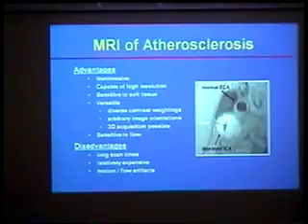But MR does have some disadvantages. The first one is that the scan time tends to be fairly long, especially compared with CT or ultrasound. In this case, you can get images of this type in several minutes; if you had a technique that can get images in real time, that certainly would be much better. Also, MR is relatively expensive. So if down the road we were to use this kind of technique as a screening tool, we will certainly need a lot of engineering input on how to make this a fast, effective way of doing the screening.